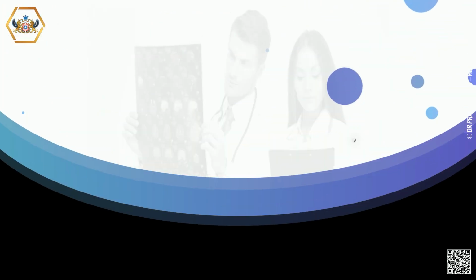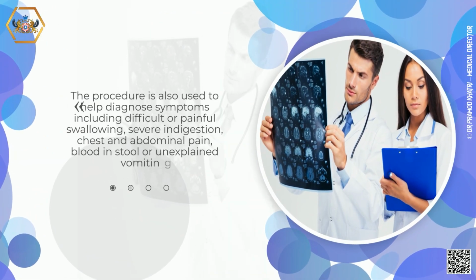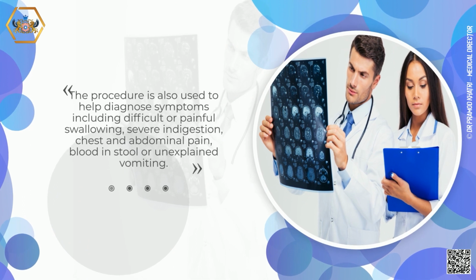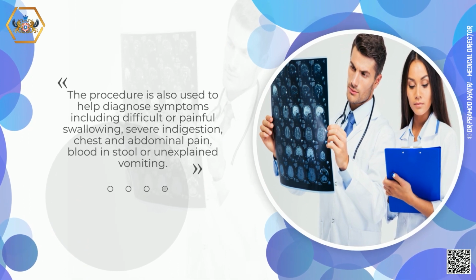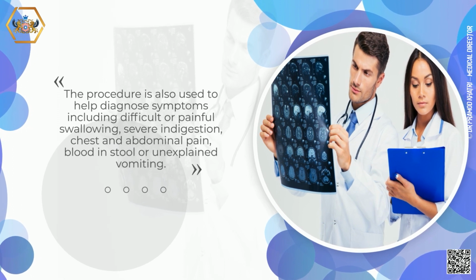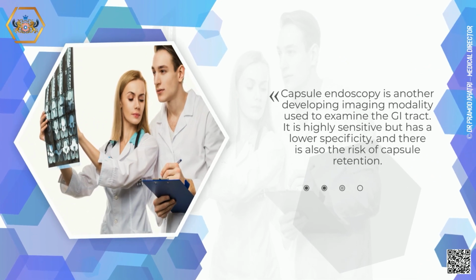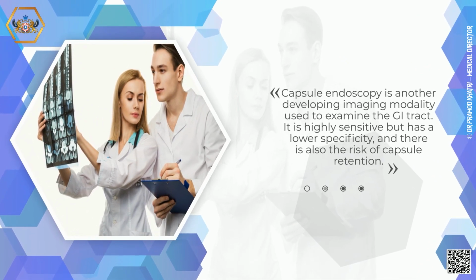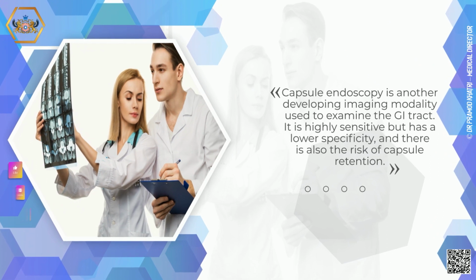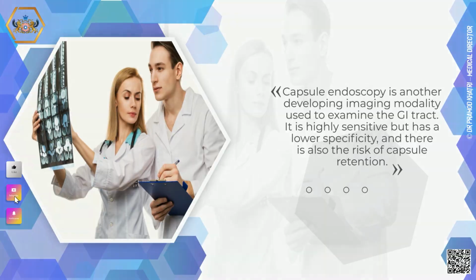The procedure is also used to help diagnose symptoms including difficult or painful swallowing, severe indigestion, chest and abdominal pain, blood in stool or unexplained vomiting. Capsule endoscopy is another developing imaging modality used to examine the GI tract. It is highly sensitive but has a lower specificity, and there is also the risk of capsule retention.